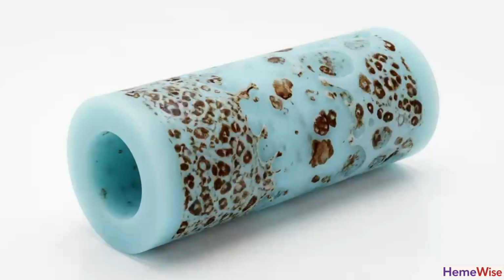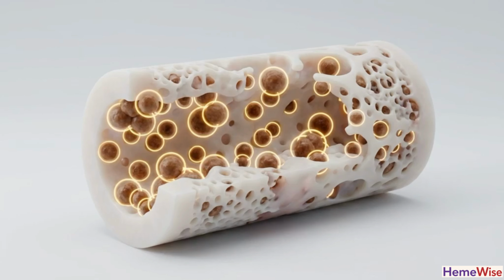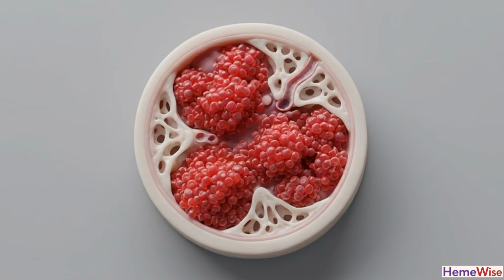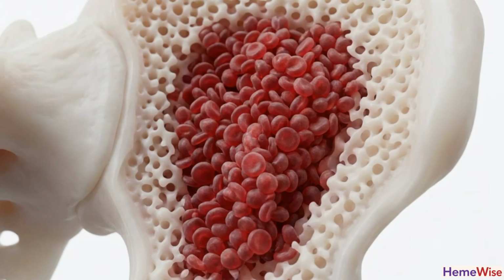To map the exact distribution of precursors within the solid tissue, we use CD34 immunohistochemistry. This highlights the percentage and location of hematopoietic blasts. In healthy marrow, precursors follow a specific distribution. The abnormal localization of immature precursors, where blasts form clusters away from bone trabeculae and vascular areas, is a key indicator of MDS or AML.